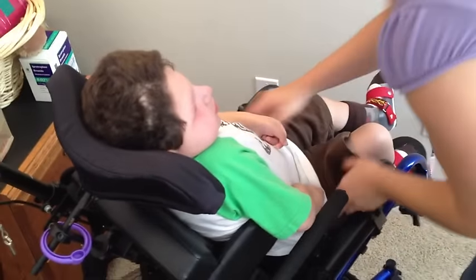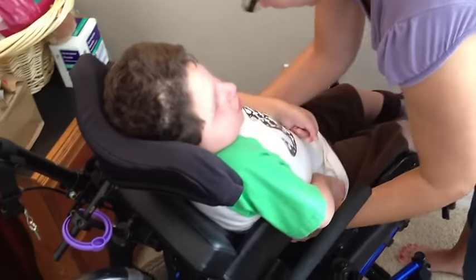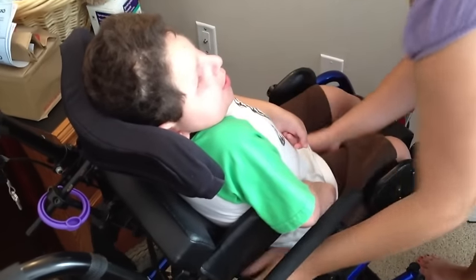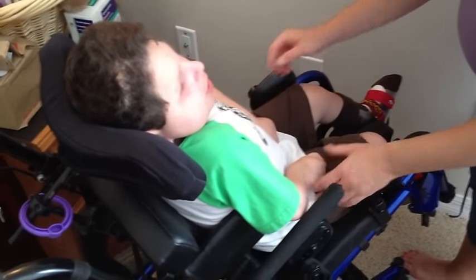You're going to want to stand in front of him and try to reposition his hips, get him in the chair all the way, nice and straight, pull his shirt down and make sure he looks pretty good.